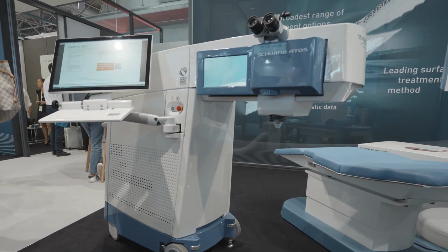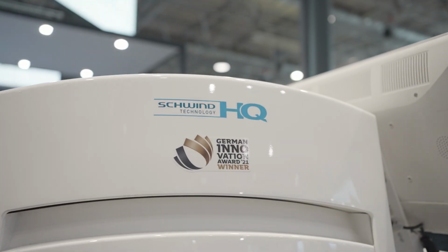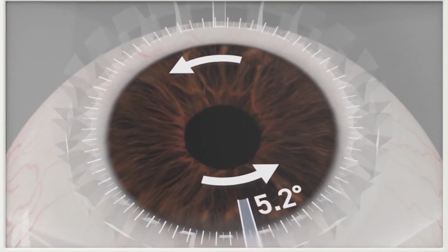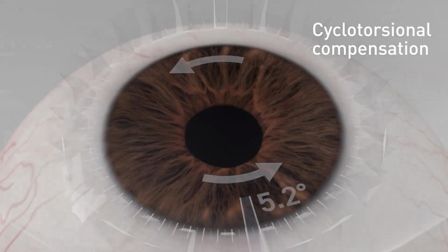One is that it's a very low energy system, which allows for quicker visual recovery. For LASIK, you're guaranteed for the flap to correspond with where you're doing the excimer laser ablation, which means you don't have a decentered flap. This reduces perioperative complications like bleeding around limbus vessels, and it reduces any problems with not being able to fit your treatment on the bed underneath your flap, which is especially relevant in hyperopic treatments or treatments where you want to achieve a large optical zone. The cyclotorsional elements are relevant because of accuracy and precision of treating astigmatism.